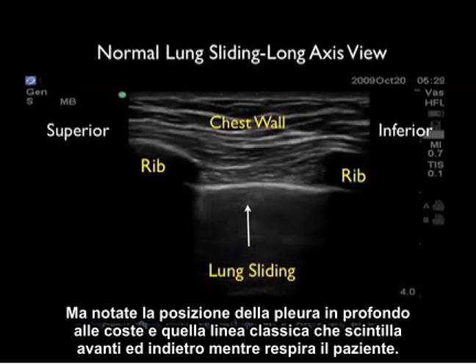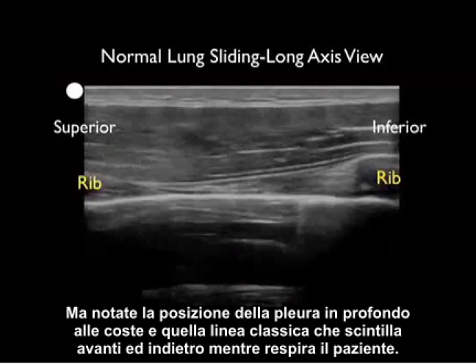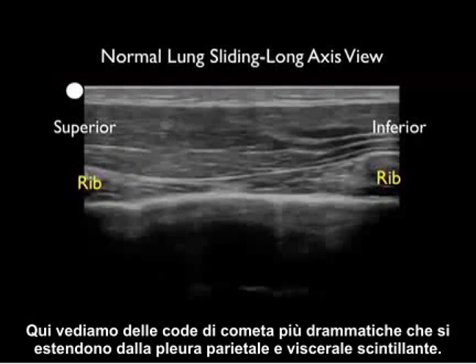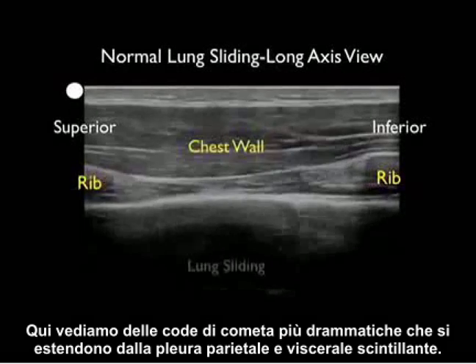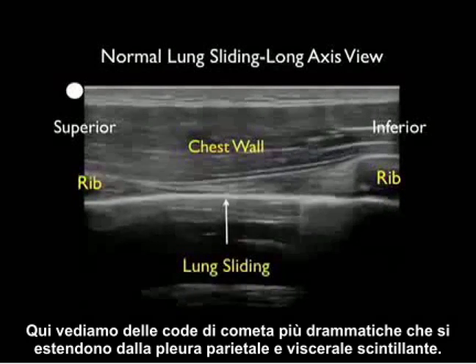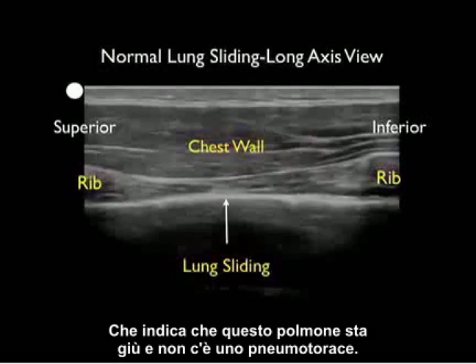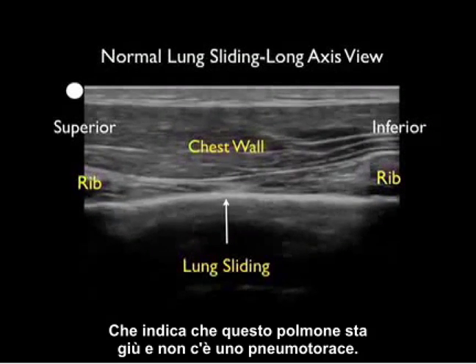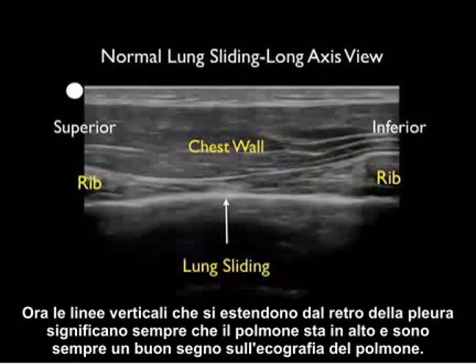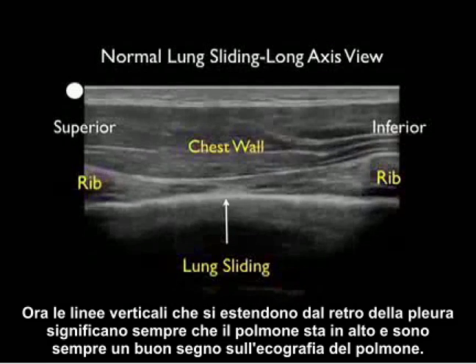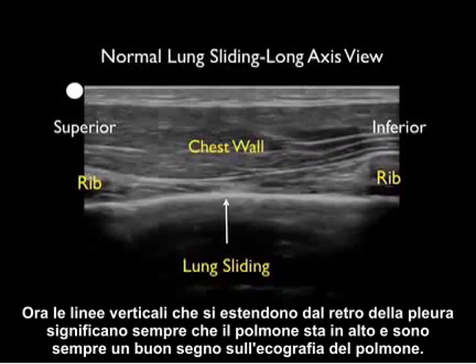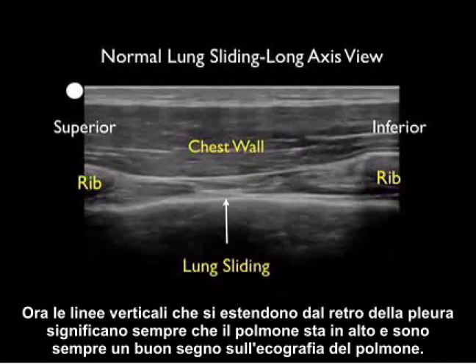Note the location of the pleura, deep to the ribs, and that classic shimmering line back and forth as the patient takes a breath. Here we see more dramatic comet tails coming off the shimmering parietal and visceral pleura. We see the comet tail shooting off the back, telling us that this lung is up and there's no pneumothorax. Vertical lines coming off the back of the pleura always mean that the lung is up and are always a good sign on lung ultrasonography.